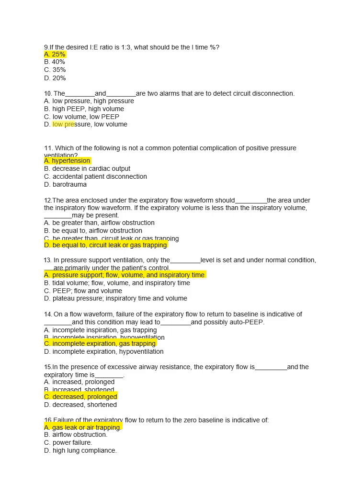Coming to the 16th question, the failure of the expiratory flow to return to the zero baseline is indicative of.